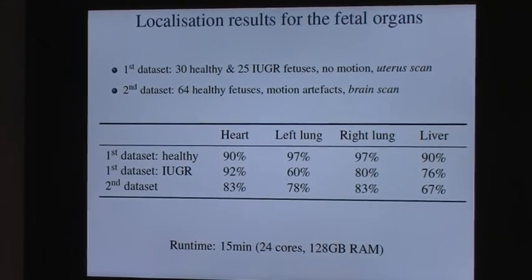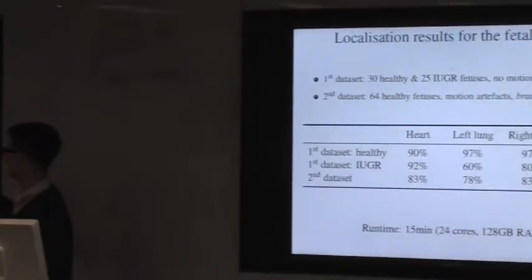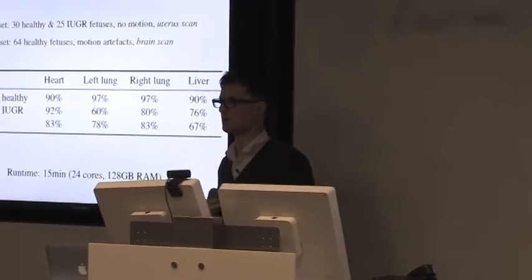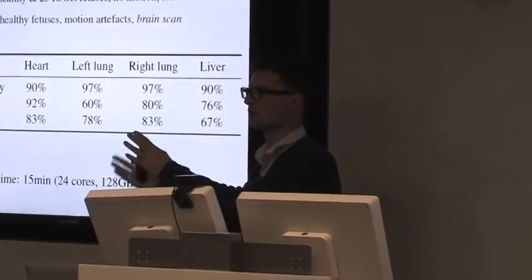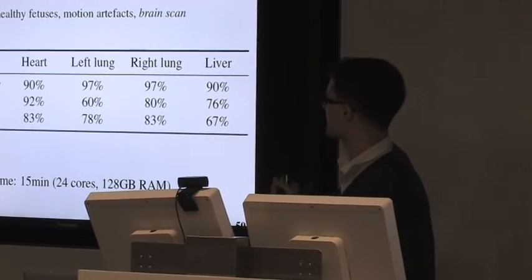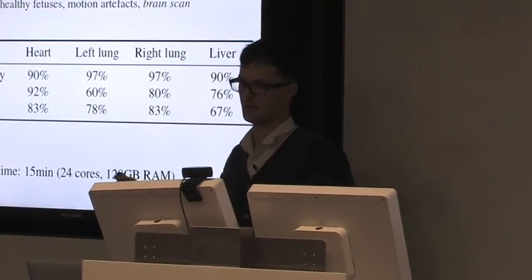And the key message is that in 90% of cases, the detected heart center was within 10 millimeter, and that's roughly enough to fit a box and get started with the cropping and the motion correction. But the main problem is the runtime. Here for that method, I end up with 15 minutes.